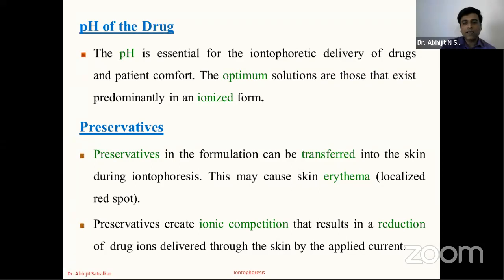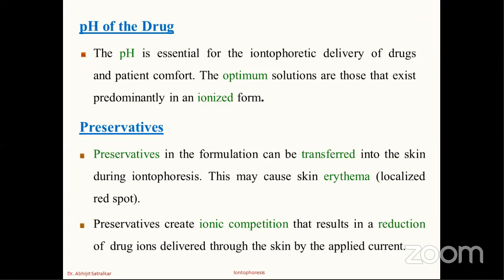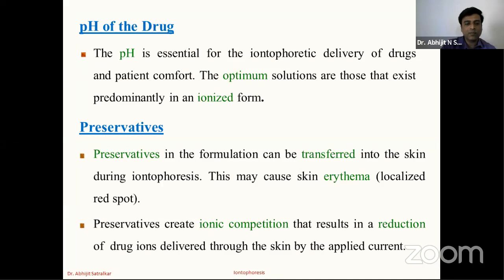Preservatives in the formulation can be transferred into the skin during iontophoresis. This may cause skin erythema, that is a localized red spot.